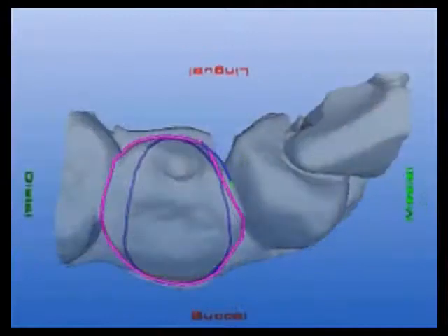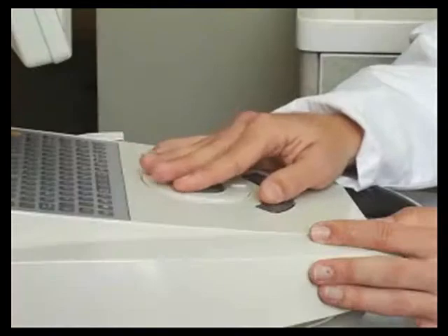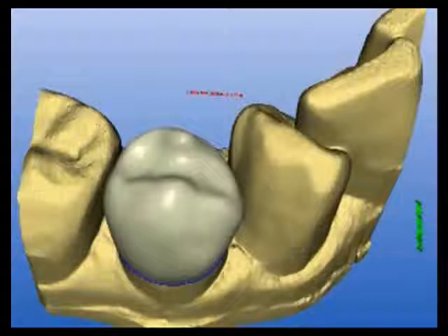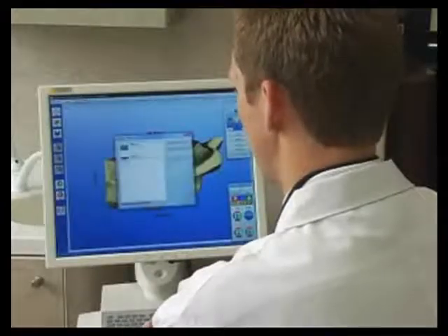Computer-aided design software allows us to design every precise detail of your restoration and allows us to customize the shape to exactly fit your specific clinical needs. Once the design is complete, it is sent electronically to our milling chamber.